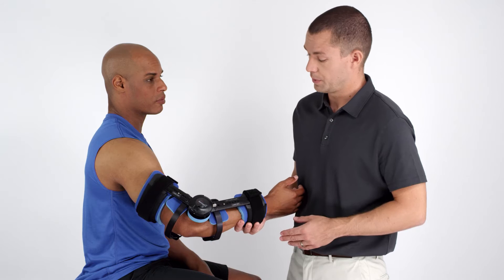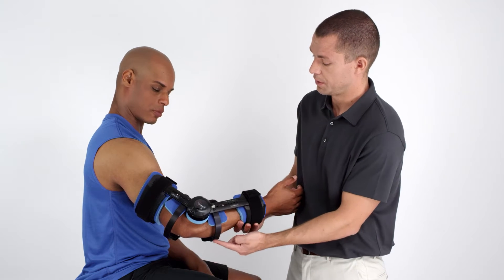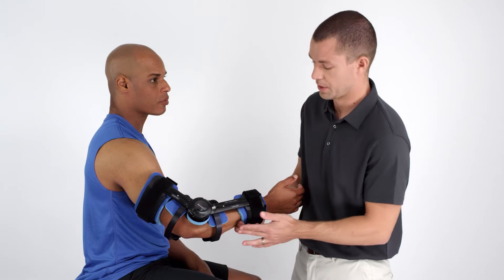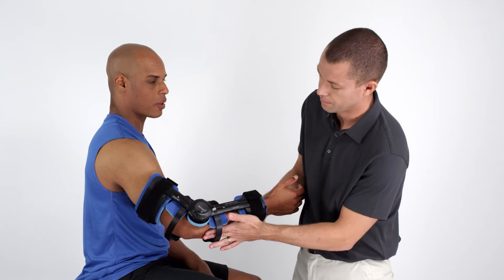On the elbow flexion orthosis, be sure that the stabilizing bars, which are nearest the joint, do not come into contact with the patient's skin.